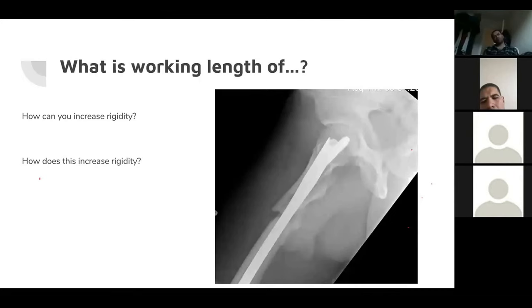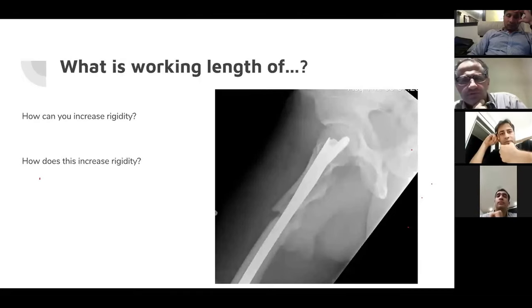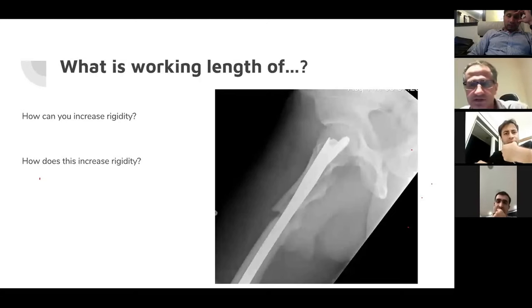And what does that do if you bring your implant modulus closer to the bone? Okay. What it does do is, first of all, yes, you're correct. Titanium is less rigid as a prosthesis. It is more flexible and has more elastic properties compared to stainless steel. However, it also, sorry, I just lost my train of thought. I apologize. We were talking about titanium versus stainless steel.